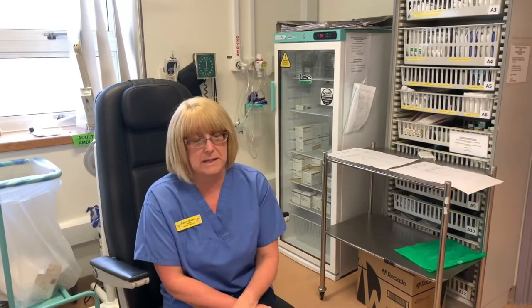It upset the patients because they could see scissors cutting across their eye. It was making them more nervous, more anxious, which wasn't helping with the injection. And guidelines from around the hospital, infection control and everything, have said it doesn't need to be. So the hospital infection control team have been quite supportive with that as well.